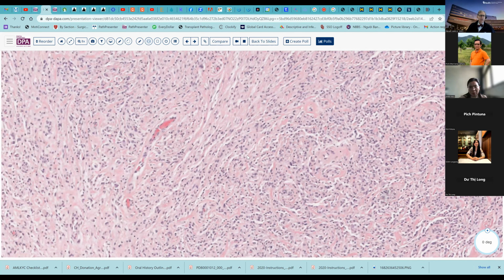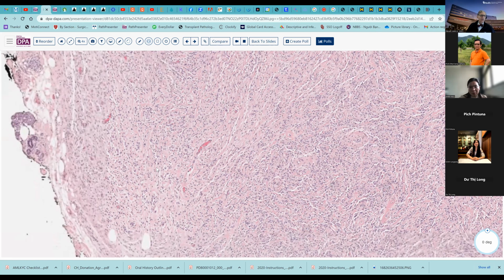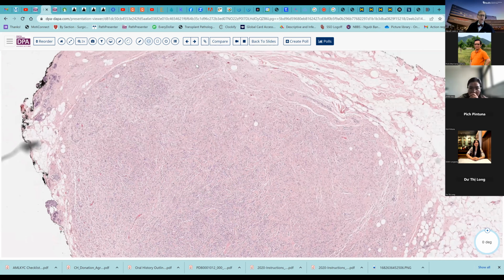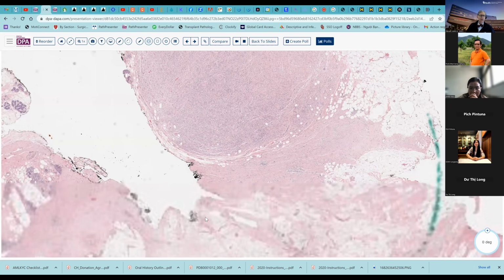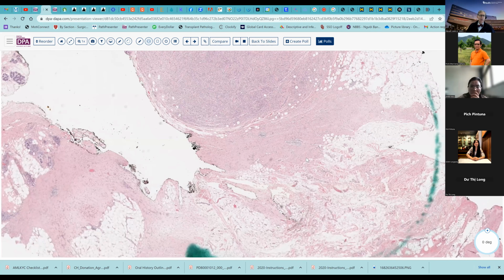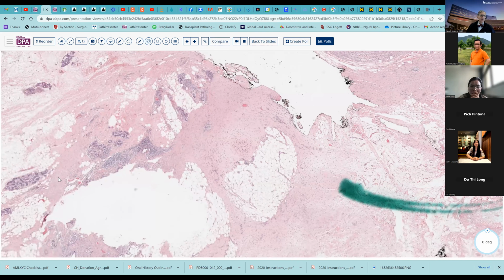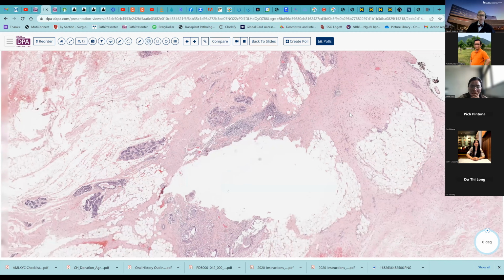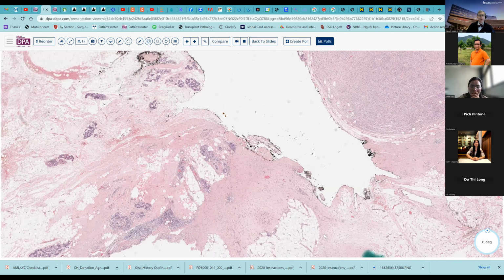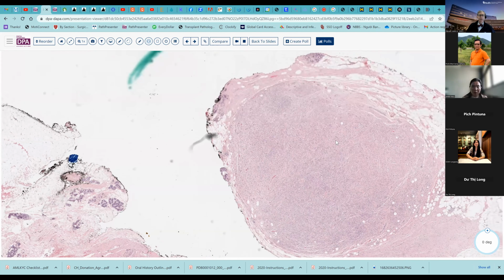Again, very delicate vasculature, entrapped fat, location in the breast or in the mammary milk line sort of thing should give you a thought to think about this lesion. Here you see the benign breast tissue adjacent to it, and so forth. So variable size, this pretty small lesion.